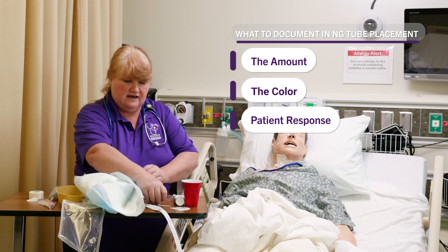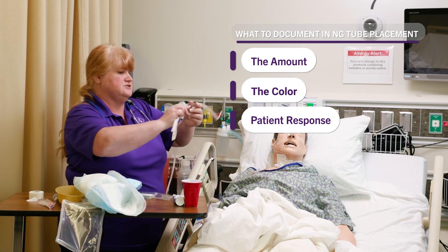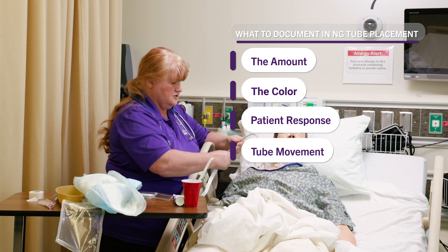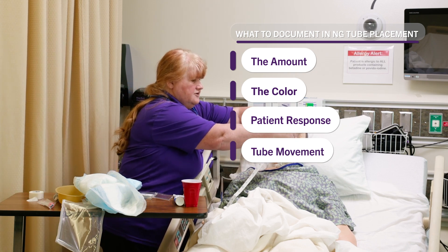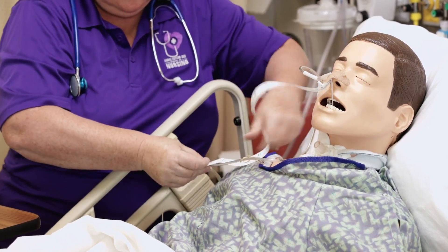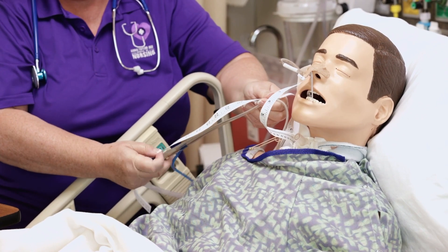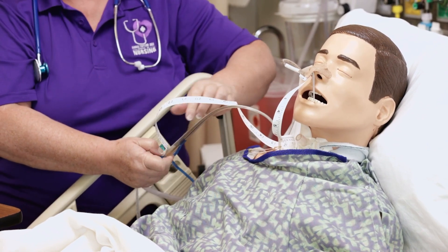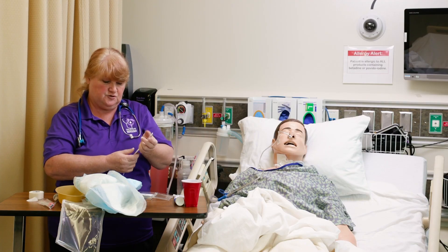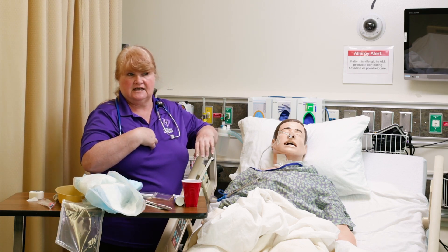The other thing you're going to want to document is how much of the tube is out. You would document from their nose around to the end of the tube, and document that every shift. We want to make sure the tube is not coming out and going up into their lungs.